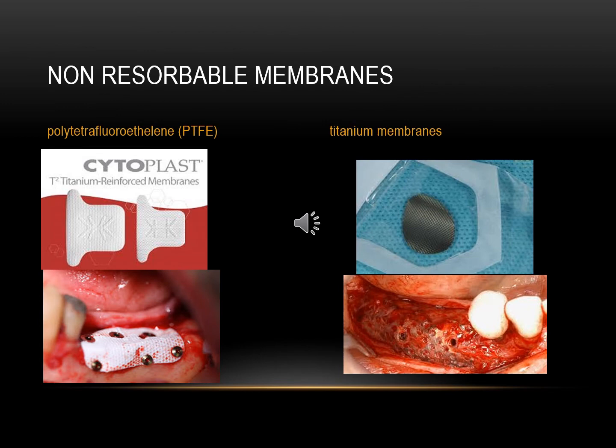In the pictures you can see the non-resorbable membrane. First picture shows the polytetrafluoroethylene membrane. The brand is Cytoplast membrane. It covers the bone graft.